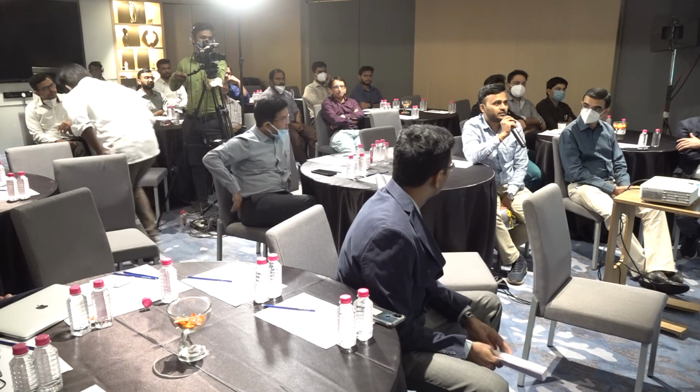She's having carcinoma esophagus, with 3 cycles of chemo and radiation. Right now there was a lesion from 25 to 30 centimeters, and it was just inflammation, and somewhere there is one ulcer. I think radiation also causes neovascularization. So will we be able to pick it up, or do I still need to take a biopsy?